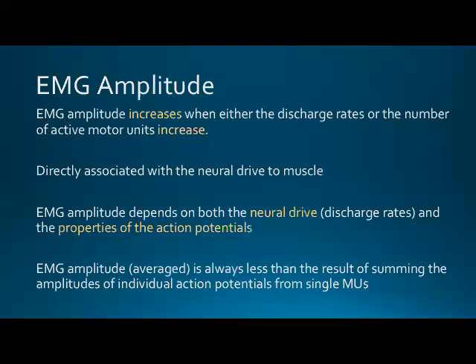We're also going to lose a certain percent of our maximal power spectrum, or the peak of that signal graph. Our low threshold motor units fall below that threshold. So if we're filtering out everything that's less than 60% of our max power, our low threshold motor units fall below that 60% threshold, and we might not even be picking up what they're doing using surface EMG.